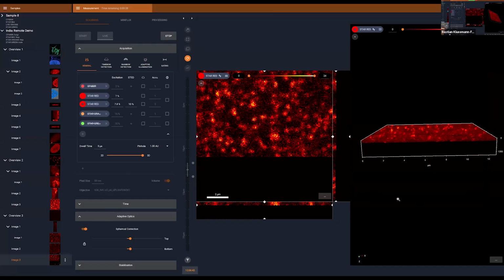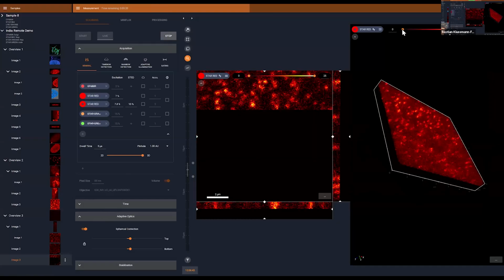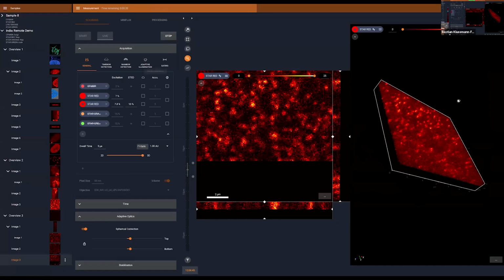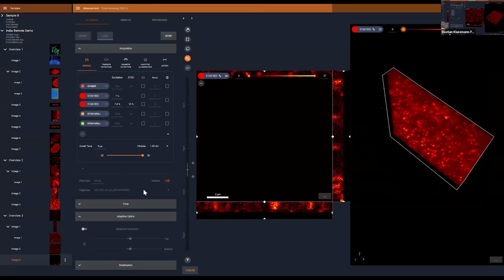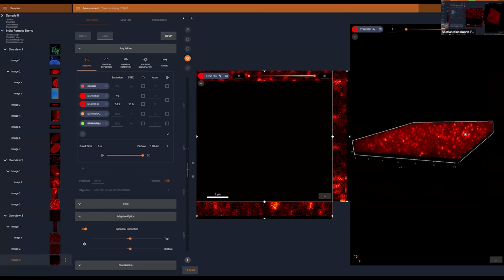Could even turn that off. And turn it on again. So it's an electronic device. As I mentioned, it's highly reproducible.